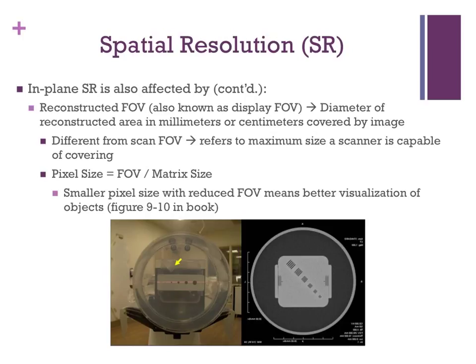Take a look at the bar pattern images from figure 9.10 in your book. The picture here shows what a bar pattern looks like on the picture on the right here, which is seen by using a phantom. Right here, this phantom.